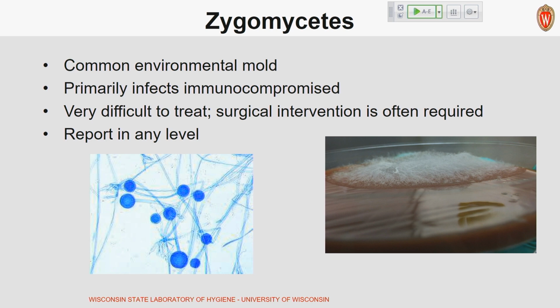If you see how fast it grows on a chocolate agar here, I think this was after 1 day, not in routine fungal incubation conditions and not on routine fungal media. This is on bacterial media, bacterial incubation conditions, and how fast it starts growing. The same thing can happen to the patient that this infects, which is why it is one of those common environmental molds that you are going to report at any level if you do encounter it, because of that potential implication.